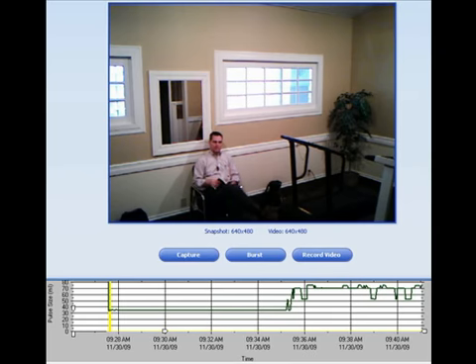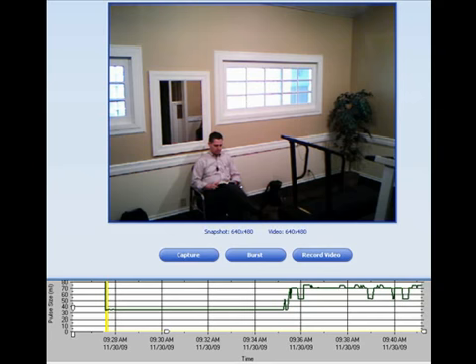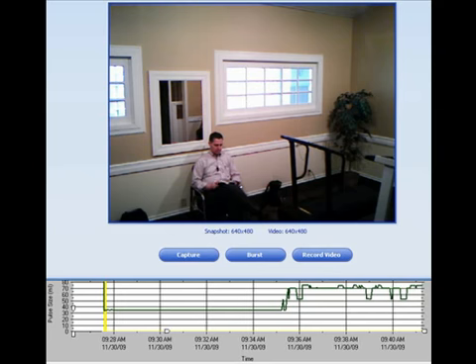As you saw previously, SmartDose will see the exertion very quickly and adjust up. However, on the transition to rest, the movement of the dose back down will have a little delay while the body recovers from the exertion. Okay, let's jump ahead yet again.